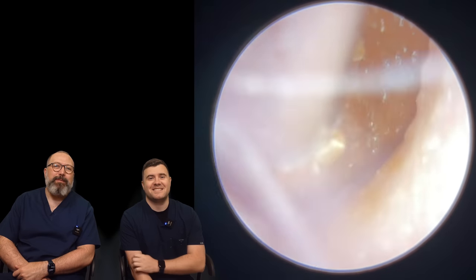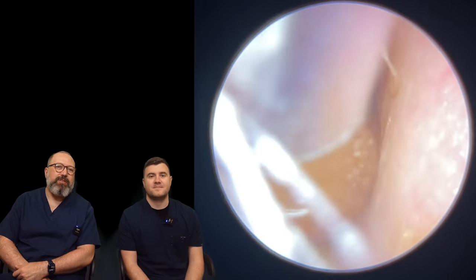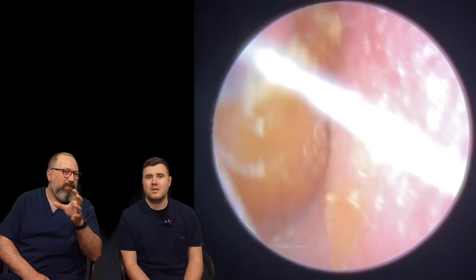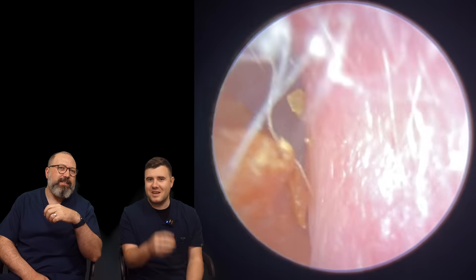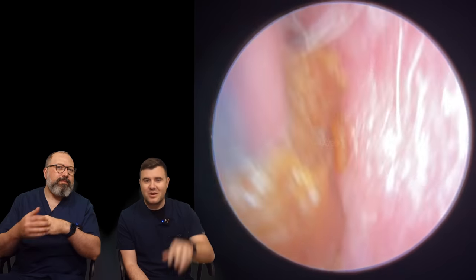So we've got the first one here, this is my patient. You can see a very, very sticky type of ear wax — this is almost that toffee consistency. Quite a narrow entrance to the canal, so we can just about get the standard size older tube in there. And the skin's quite flexible at the entrance as well. You can see that kind of stretching as the suction tube just touched on the front of it.